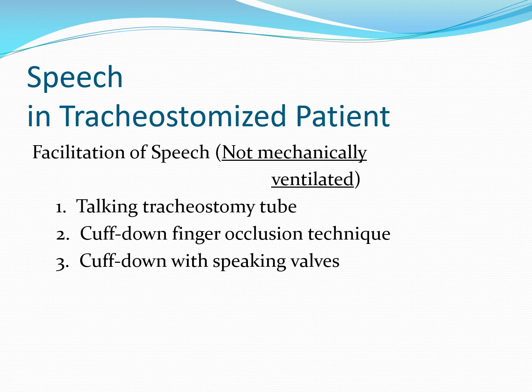They're sometimes called talking tracheostomy tubes, cuffed down, so that with a clean gloved hand, the cuff can be deflated and the finger can occlude the, if you will, proximal end of the tracheostomy tube.